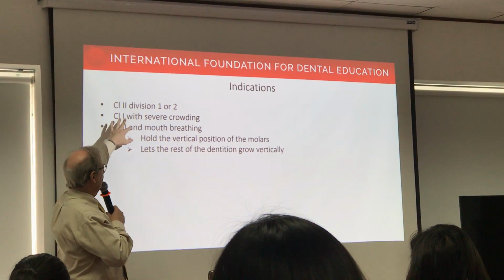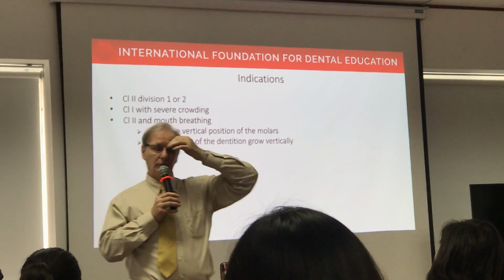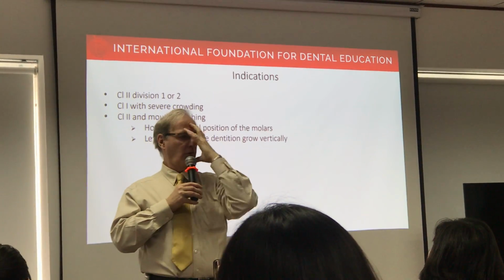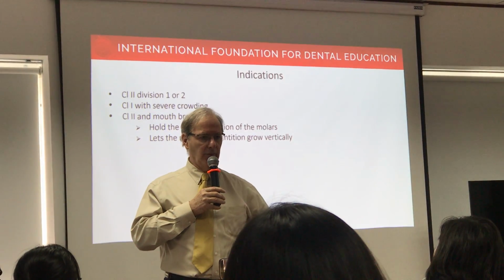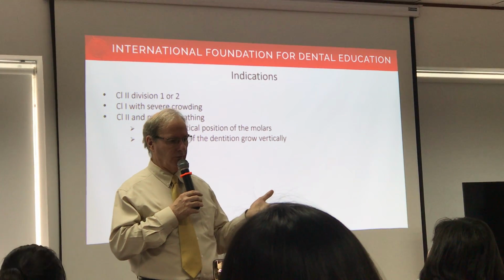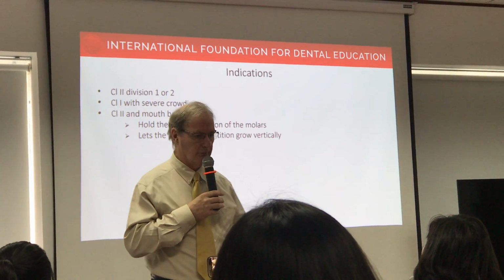The headgear, you see that Dr. K gave you a lecture yesterday and Dr. Fong gave you a lecture about class 3. You have no issues stuffing a face mask on a patient, right? Protraction, and you will tell them, but then you will not use a headgear, which is kind of dumb, because for class 2 division 2, it's the best appliance.